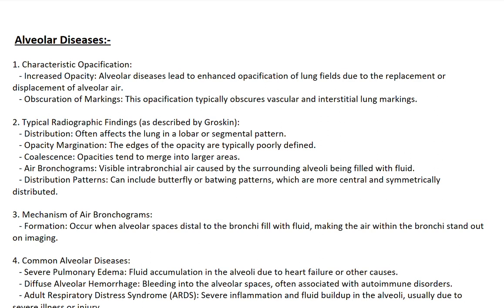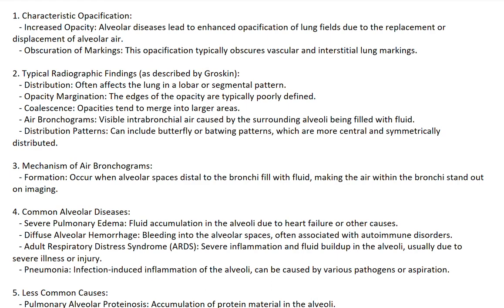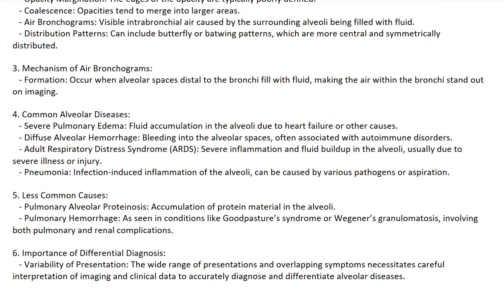3. Mechanism of air bronchograms. Formation occurs when alveolar spaces distal to the bronchi fill with fluid, making the air within the bronchi stand out on imaging. 4. Common alveolar diseases. Severe pulmonary edema, fluid accumulation in the alveoli due to heart failure or other causes. Diffuse alveolar hemorrhage, bleeding into the alveolar spaces often associated with autoimmune disorders.